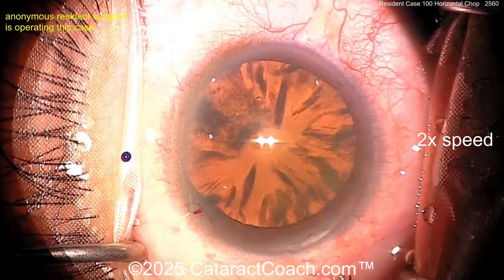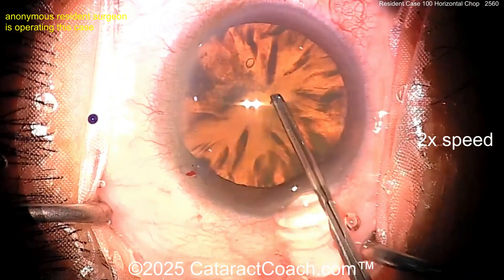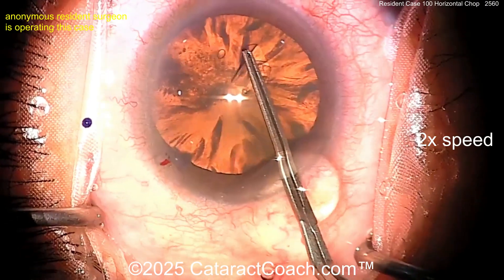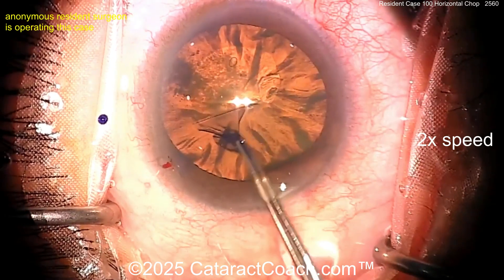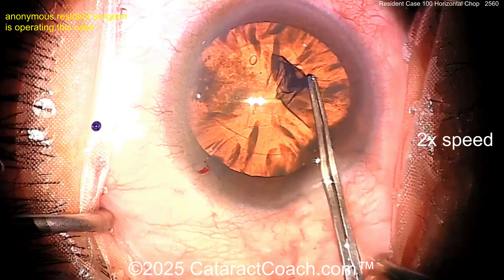I wish it hit a little bit more of the limbal vessels though — it's a little too much in the clear cornea for me. Remember, if you barely nick the limbal vessels, it heals much better. Now starting off here with the capsulorhexis — no, just forceps going in there, starting the rhexis. Very nicely done.